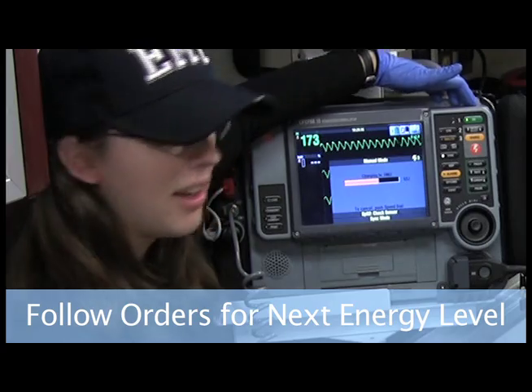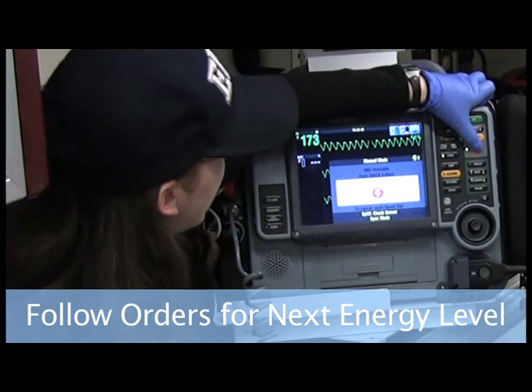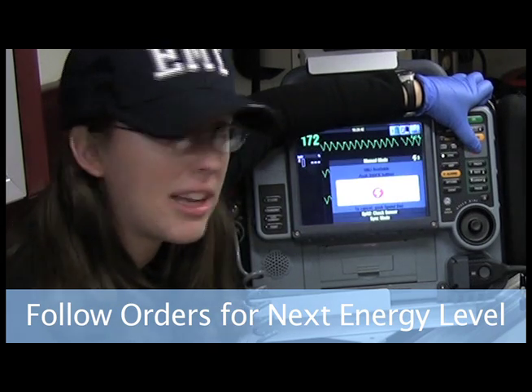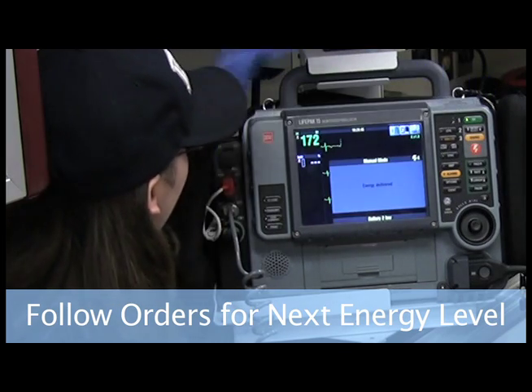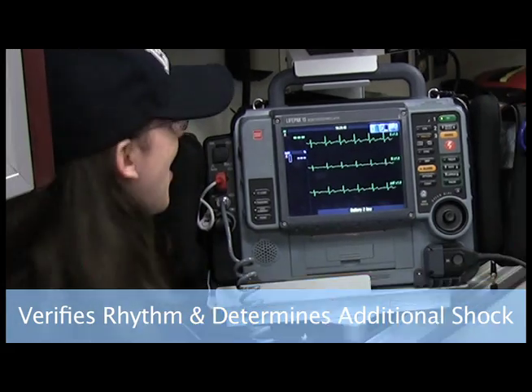So I'm going to hit charge. Are you clear? I'm clear. Everyone's clear of the patient. I'm going to hit shocking, holding down the button until I hear that click. And look at that — I am seeing normal sinus rhythm on the monitor.